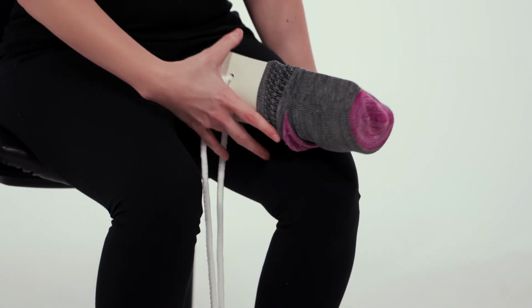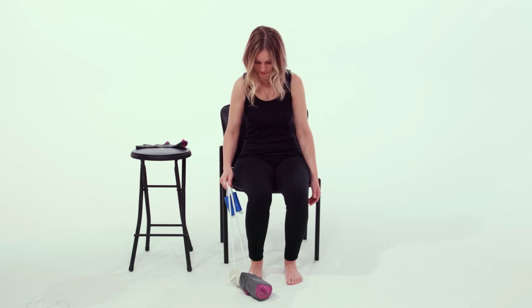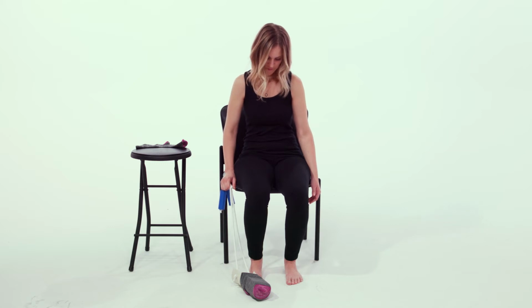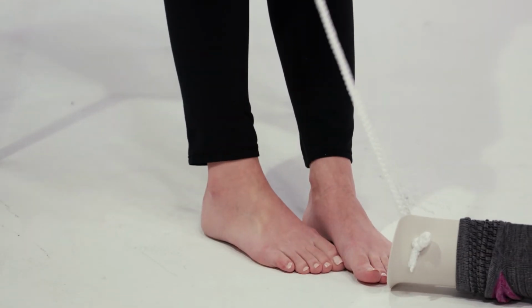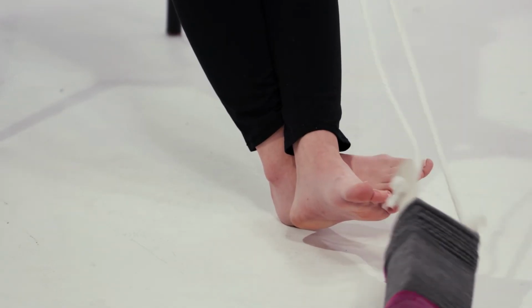Take the rope and drop the sock aid down to the floor. Position it so that the opening is facing up. Insert your affected foot into the sock aid and push it through as far as you can.